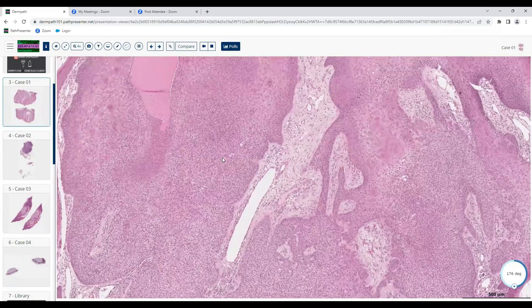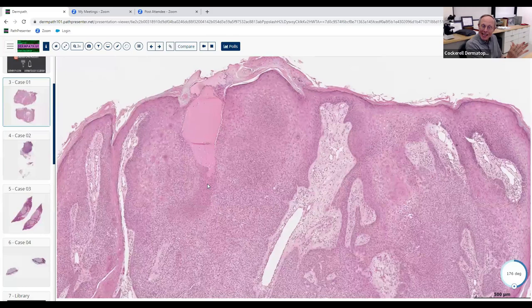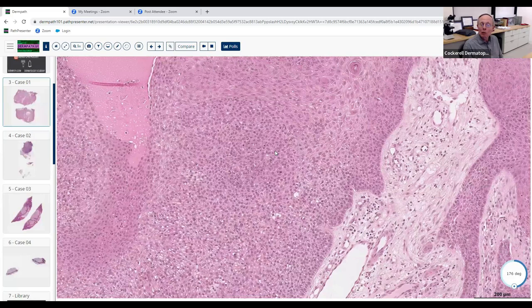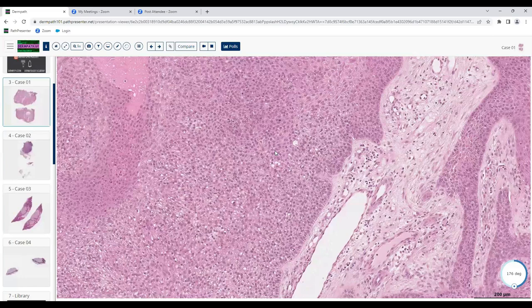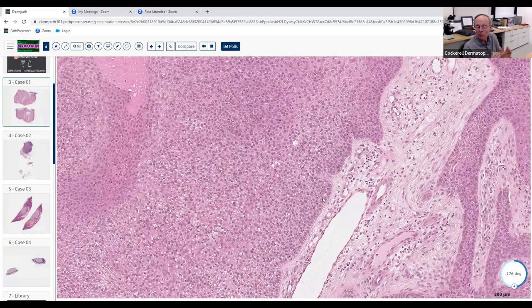What else would you think? You could consider a trichilemmoma or even a basal cell — so maybe tricholemmal differentiation. Instead of going down the sweat gland path, maybe more follicular. Now, what does tricholemmal mean in English? It relates to the hair root sheath — the external root sheath. At the periphery of the inferior hair follicle you get those cells, then clear cells internally, then the tricholemmal zone and hair shaft formation.